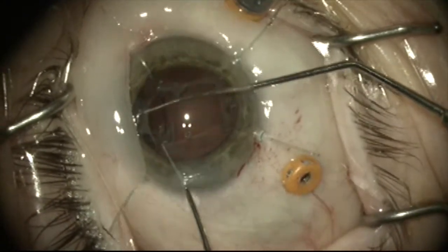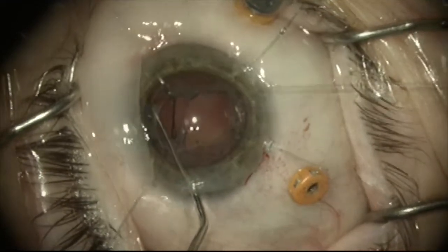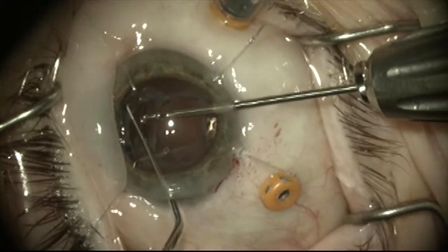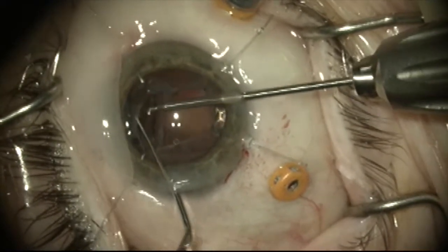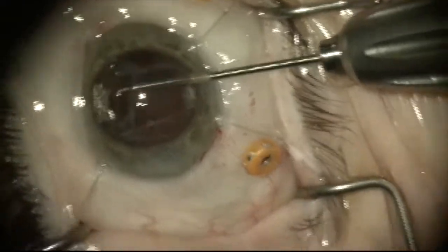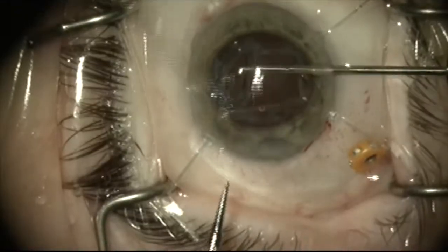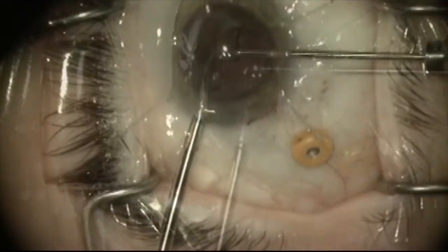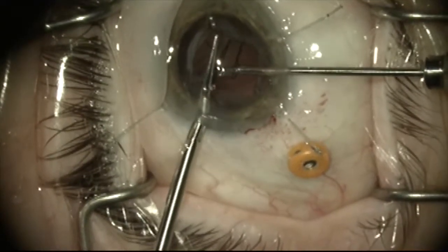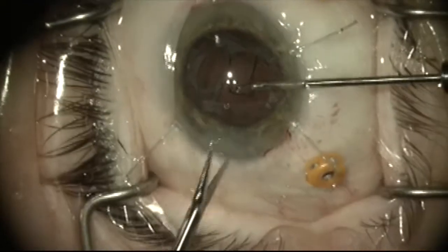The other plate will be flipped up and I'll use a Sinski hook to hold it while I switch instruments and grab it with a micro forcep. While I'm holding the plate, I'll rotate the microscope a bit with my left hand so I have a better angle using a scissor in my left hand, and now I can get a good angle on this haptic, this plate, and cut this short so that I don't have to worry about it migrating into the visual axis.